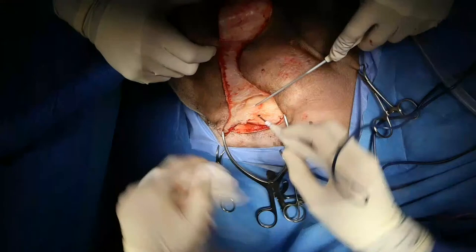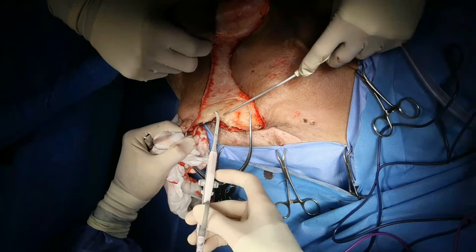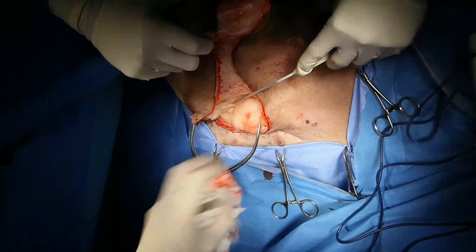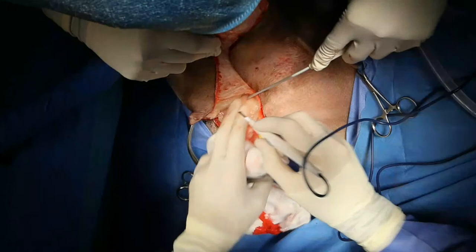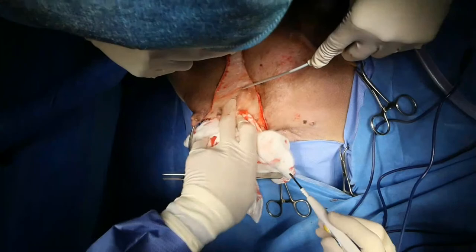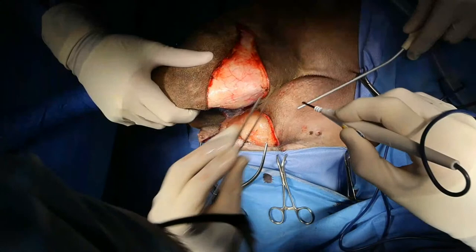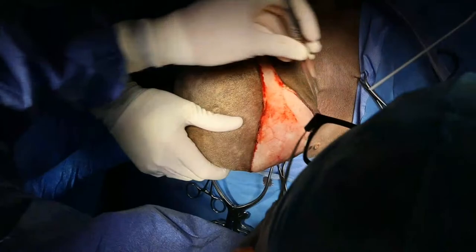So I'm just going to dissect down through here and get to our pubic symphysis, and I have to split the adductor muscles one side from the other. Kind of the same approach that you would do doing a triple pelvic osteotomy or in doing a juvenile pubic symphysiodesis. So I'm down to the pubis right here. So I'm just going to bring my skin down. I'm just trying to get increased exposure before I start cutting stuff, because if I inadvertently cut a big vessel, I want to make sure that I've got exposure to identify that bleeder and to address it.